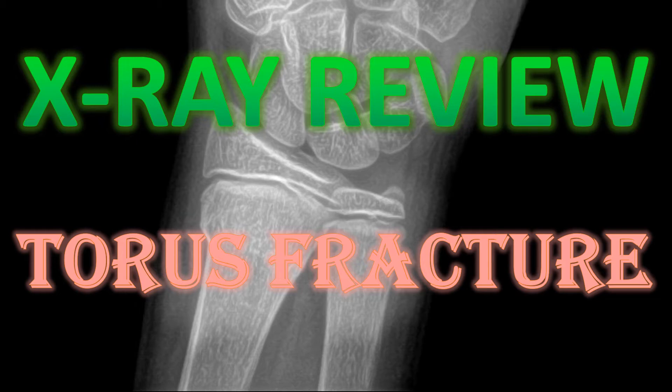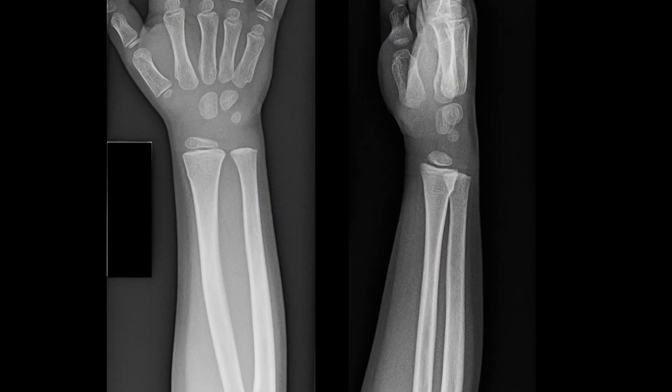Welcome to X-ray Review. This is a quick video about torus or buckling fractures, which typically occur in kids, usually as a result of a fall on an outstretched hand — a FOOSH injury. The most common location is the distal radius. This is a classic example of a torus fracture. These are incomplete fractures usually of the shaft of a long bone, and what you'll see is a bulging out of the cortex.